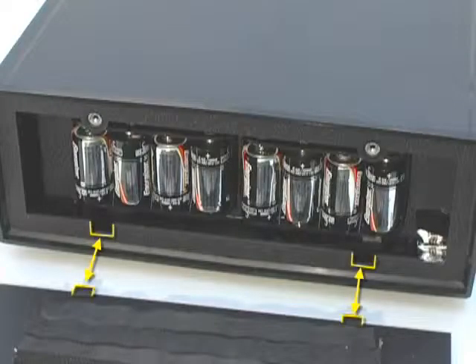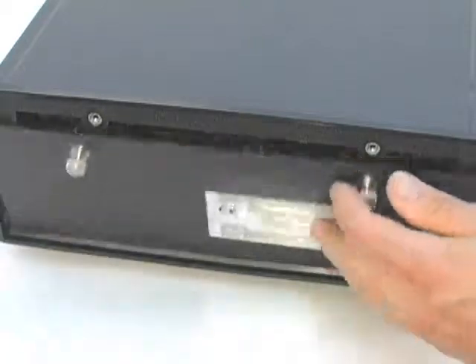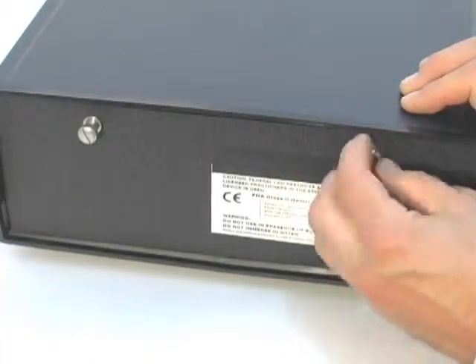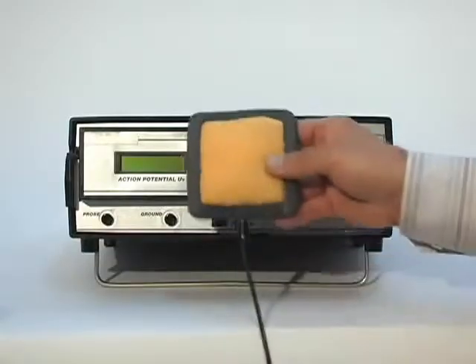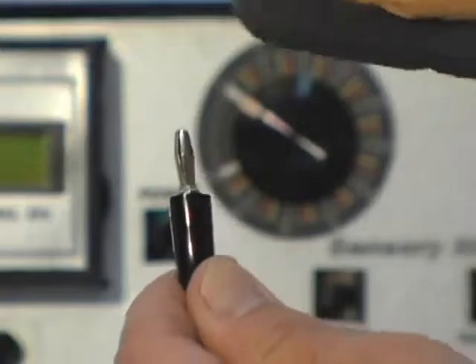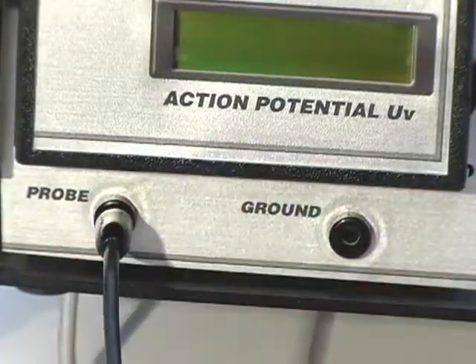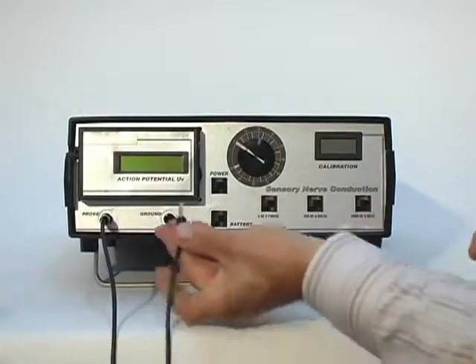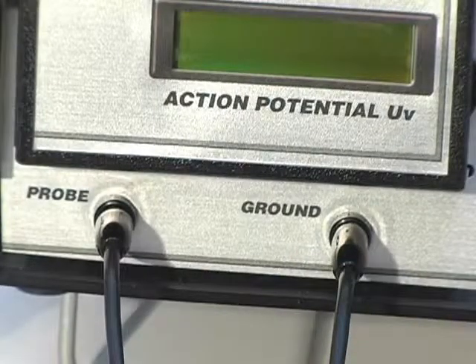Replace the cover plate by inserting the tabs on the plate behind the edge of the cutouts on the compartment. Then tilt the plate into the closed position and tighten the knobs. To check the device, disconnect the cable from the rubber sponge holder. With the power off, plug one end of the cable into the probe port on the device and the other end of the same cable into the ground port.